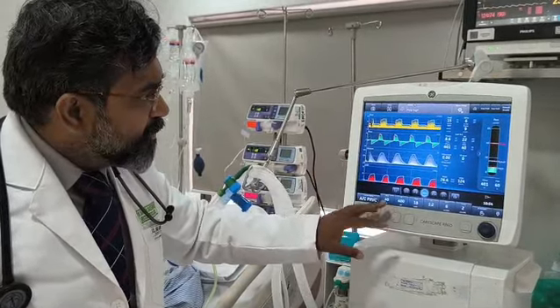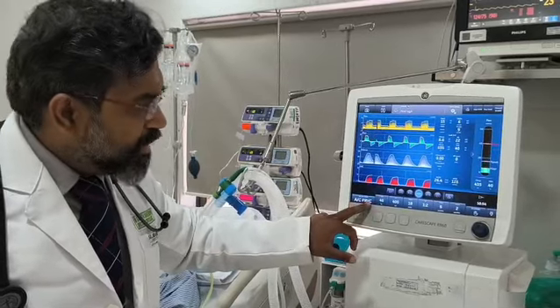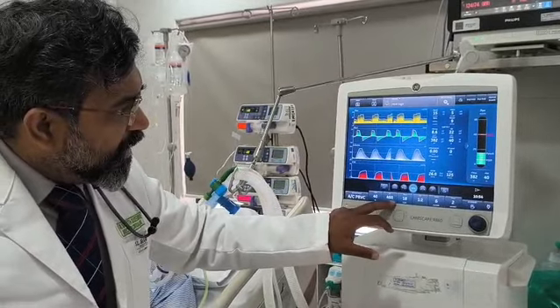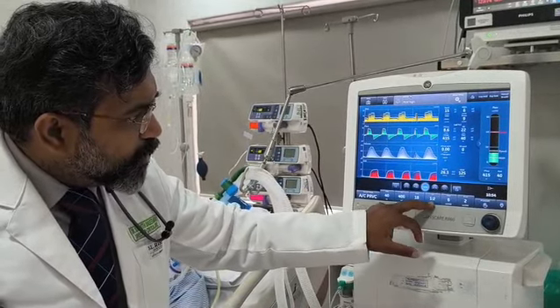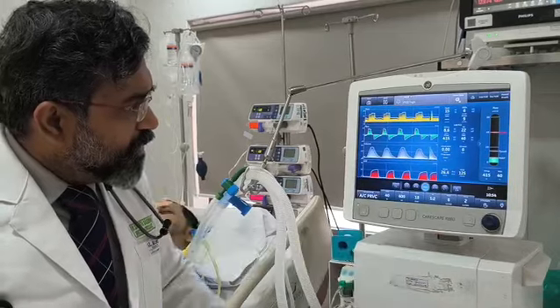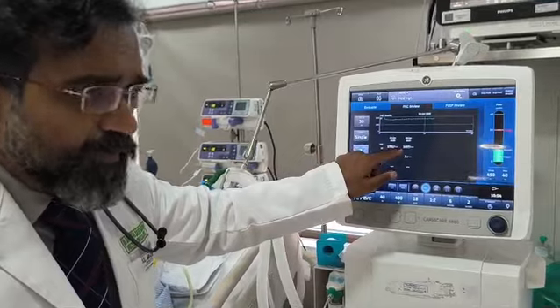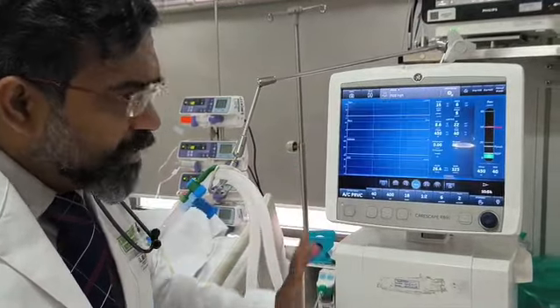So we can see very clearly that the patient is on PRVC mode, that is pressure regulated volume control, with a FiO2 of 40, tidal volume of 400, respiratory rate of 18, I ratio of 1:2, PEEP of 6, and P minimum of 2. We've actually found the FRC. The FRC over here is somewhere around 1657. That's the FRC. That's pretty good for this particular patient.